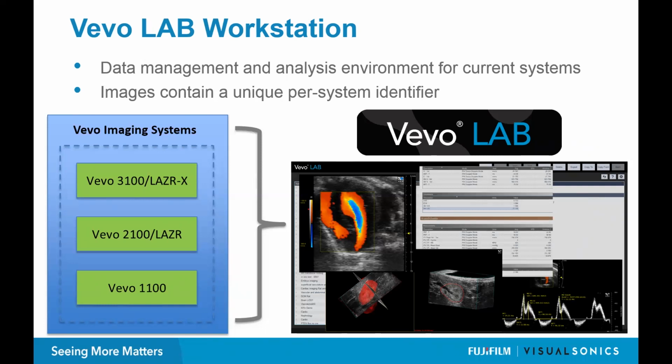This is really a centralized data management and analysis environment that has become a product on its own that we've really used as a platform to develop a lot of really interesting measurements, calculations, and tools to manipulate and analyze data. And just to highlight again the different systems that we've been talking about here, everything from the 3100 and LAZR-X, going back to the older systems, the 2100 and LAZR and the Vevo 1100, data from all of those systems is all supported by Vevo LAB.